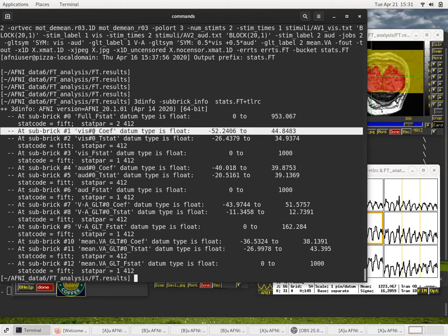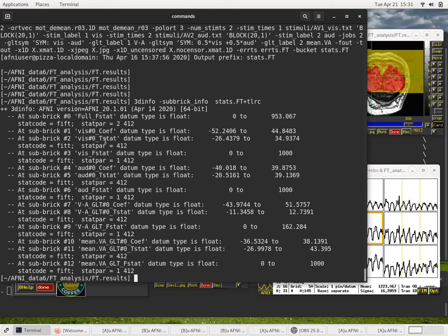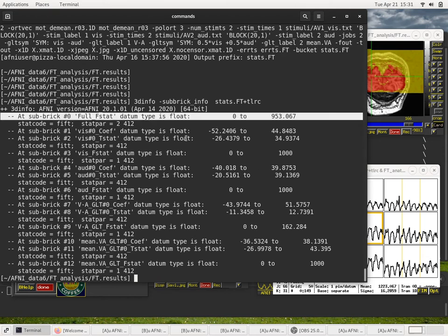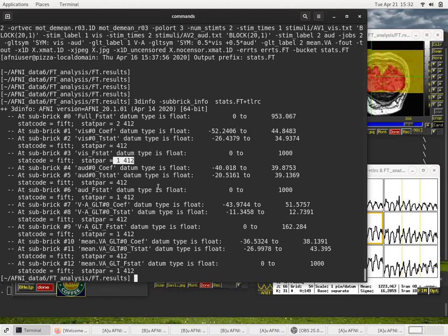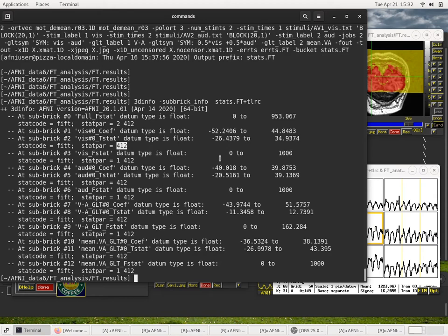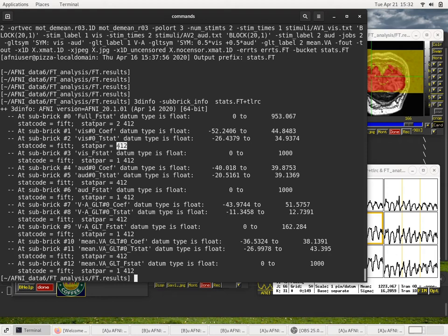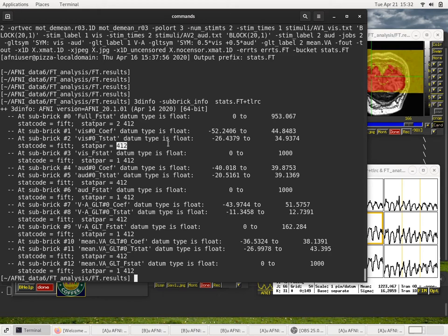Instead of verb, if we just want subric info, we can say subric info is an option and that won't output the history. Dash subric info is just that stuff. So you can also see the list of volume indices in here. The ranges for each of these, they're float indices. It gives the statistical parameters for the full F stat and then the individual F stats and then the T stat.